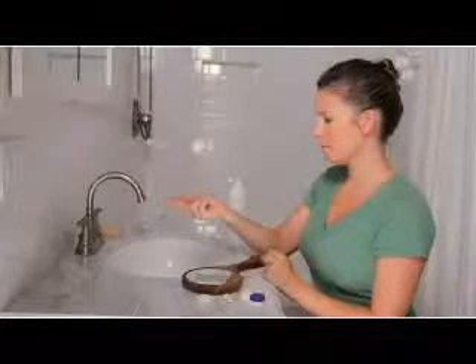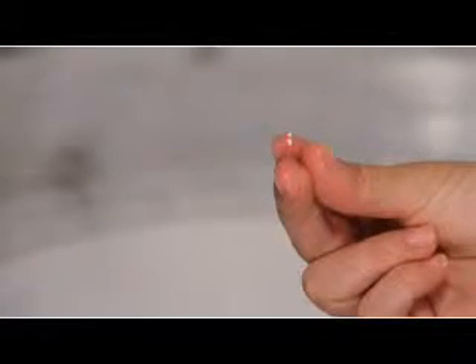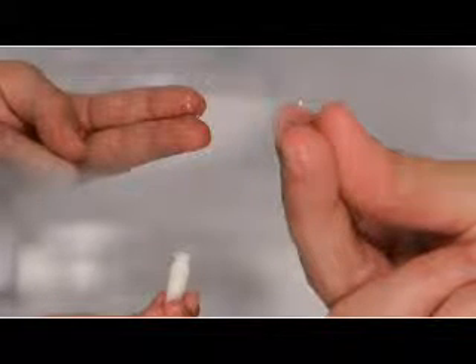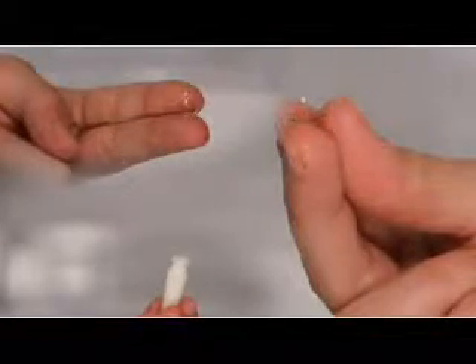There are three ways to hold the lens for insertion. One way is to stabilize the lens by placing it between your index and middle fingers. If you prefer, you can also use a tripod method or three-finger approach, using your thumb, middle, and index finger to balance the lens on the tips of your fingers. Another option is to use a contact lens inserter, sometimes called a DMV inserter. You should use the method that is most comfortable for you. This video will demonstrate the two-finger method for one eye and the contact lens inserter for the other eye.